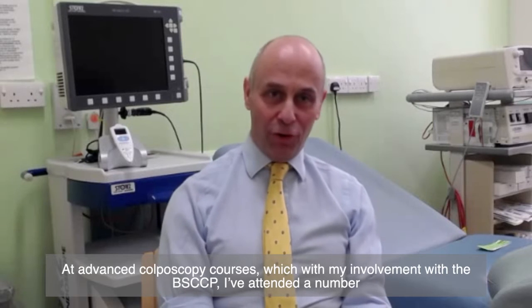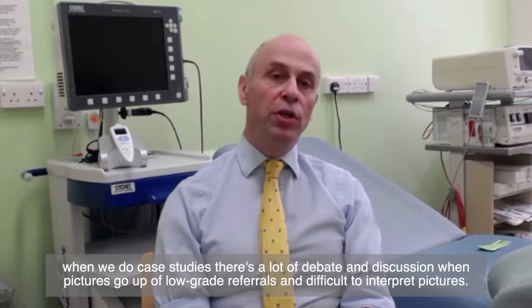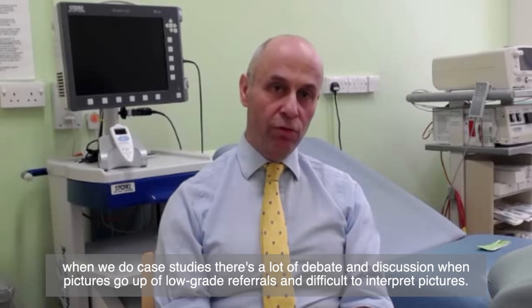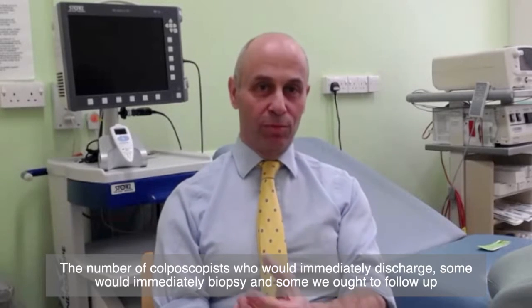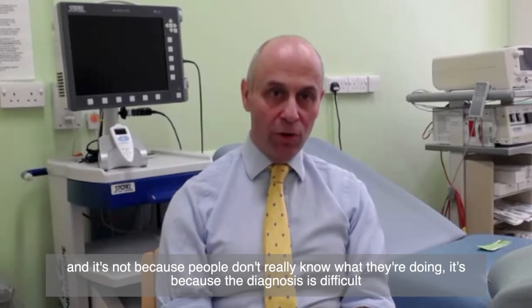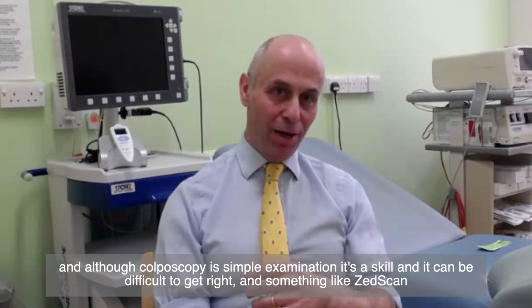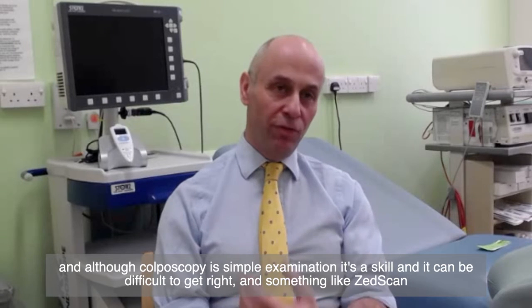At advanced colposcopy courses, which, because of my involvement with the BSCCP, I've attended a number, when we do case studies, there's a lot of debate and discussion when pictures go up of low-grade referrals and difficult to interpret pictures. The number of colposcopists who would immediately discharge, some would immediately biopsy, some would want to follow up. And it's not because people don't really know what they're doing, it's because the diagnosis is difficult. And although colposcopy may be a simple examination, it's a skill and it can be difficult to get right.